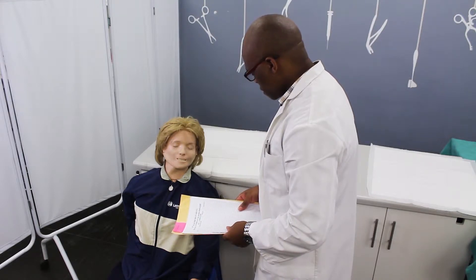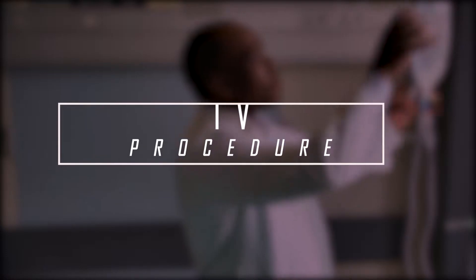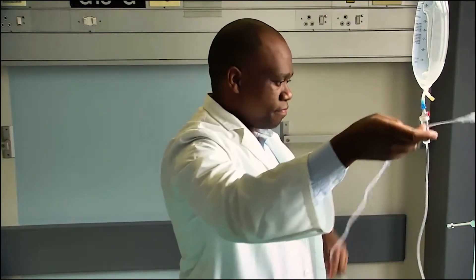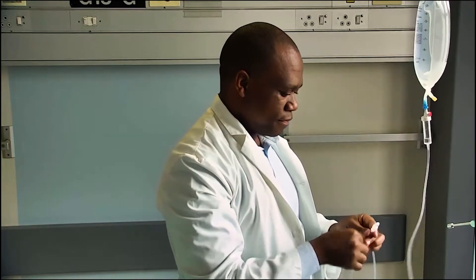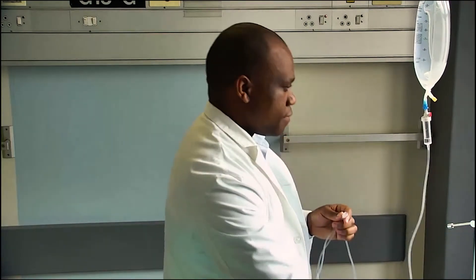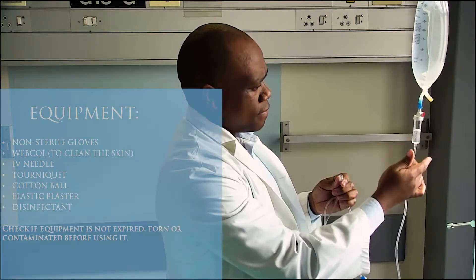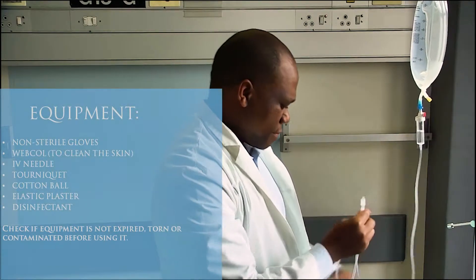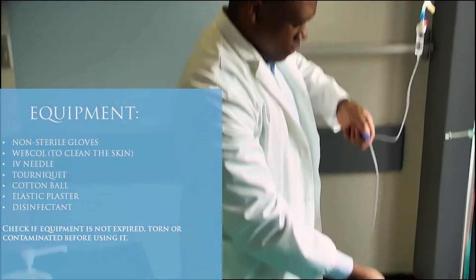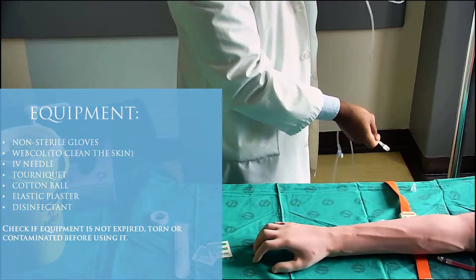Prepare the equipment. Attach the intravenous infusion set to the appropriate choice of fluid and fill the set. Ensure that there are no bubbles on the administration set. Hang the set on the drip stand.